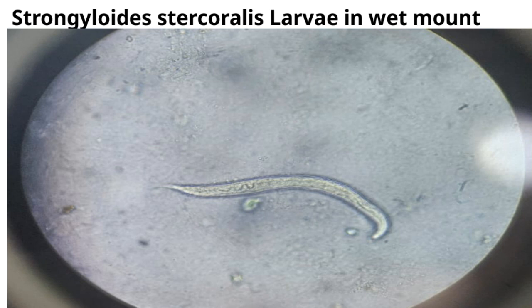So, when you're examining a wet mount, keep an eye out for these distinctive larvae. They're a vital clue in understanding and managing infections caused by Strongyloides stercoralis.